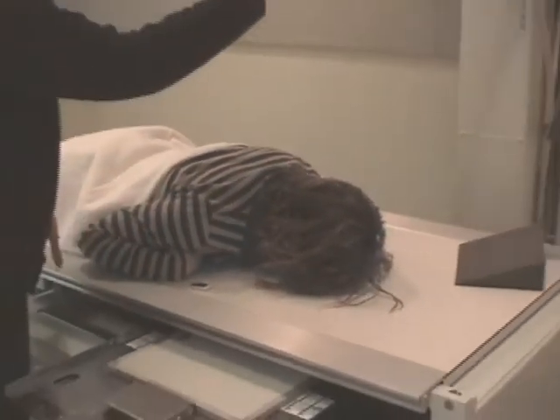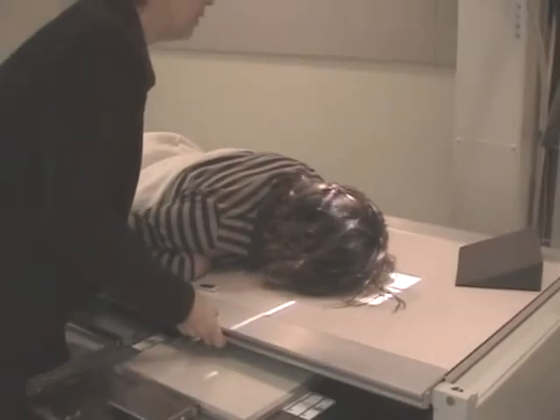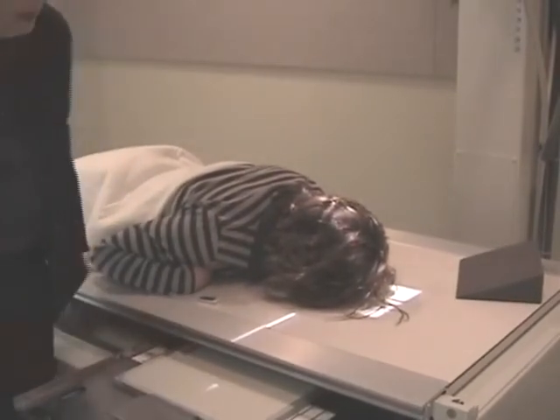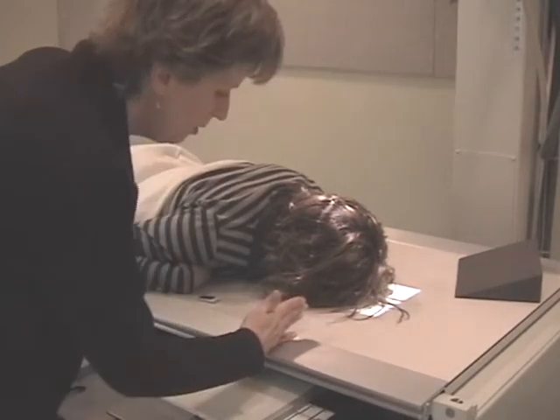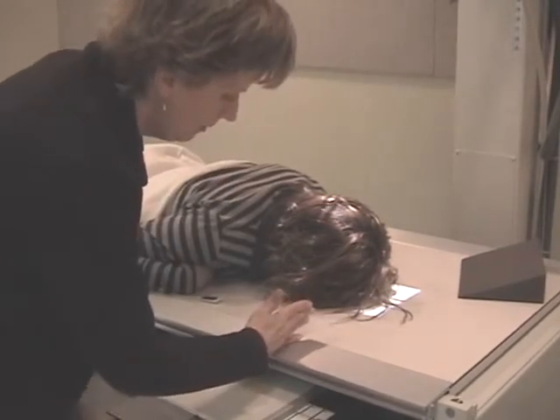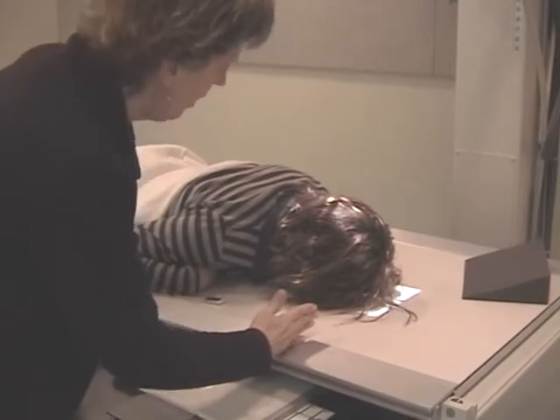And then I'm going to go to the head of the table, make sure the MSP is centered, and the film's edge, you can use the film's edge being 2 inches above the vertex. We talked about that earlier with the AP.